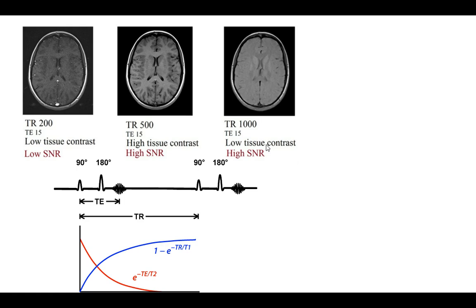Because remember, this doesn't actually fully show the thing. There's the kick and the pulse. That's technically measuring T2. For measuring T1, there is an initial kick to excite it, then you let it decay, then you give it another kick. So there are two of these 90s and then a 180, with a time between those. So 90, 90, 180, there's space between, and it's from the second 90 that you read this.